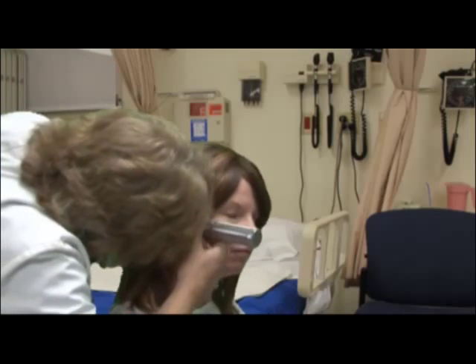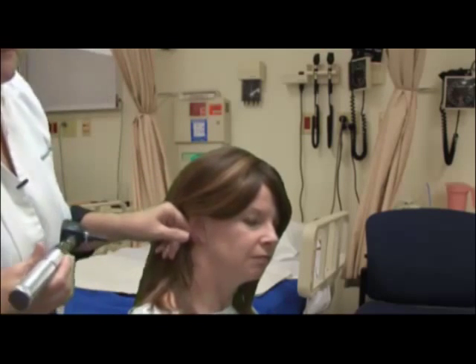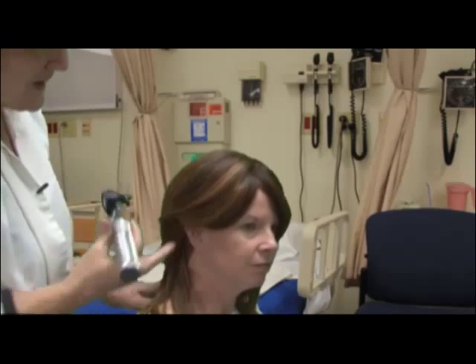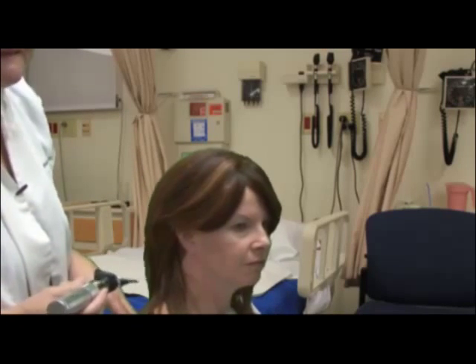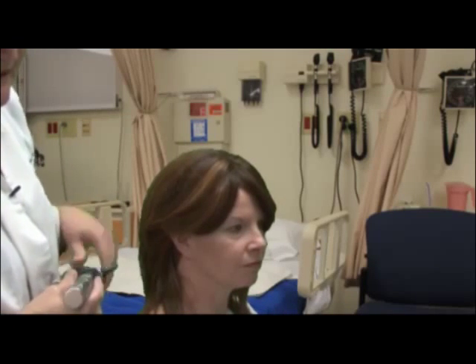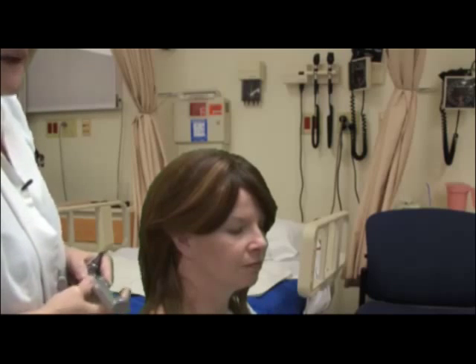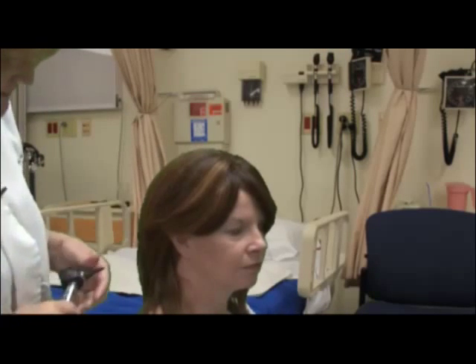Once you get it in, point it towards her nose, and you're looking for the tympanic membrane, which is called the TM, and what you're going to see is pearly gray. You also might see a light reflex. The light reflex is in the 5 o'clock. This is her right ear. So it's in the 5 o'clock spot, and it's like a cone of light, and it should be very clear.